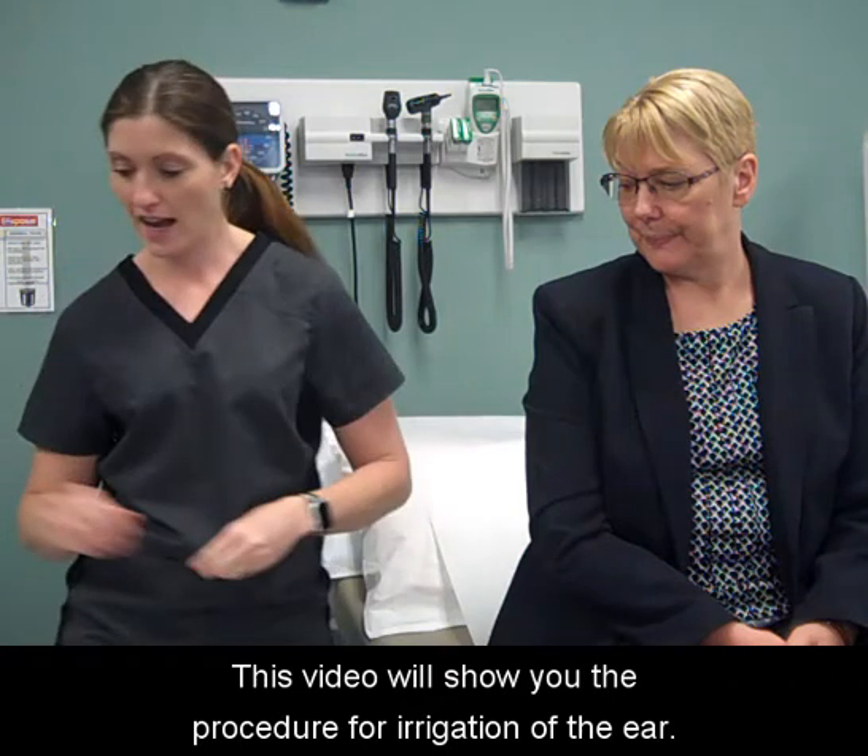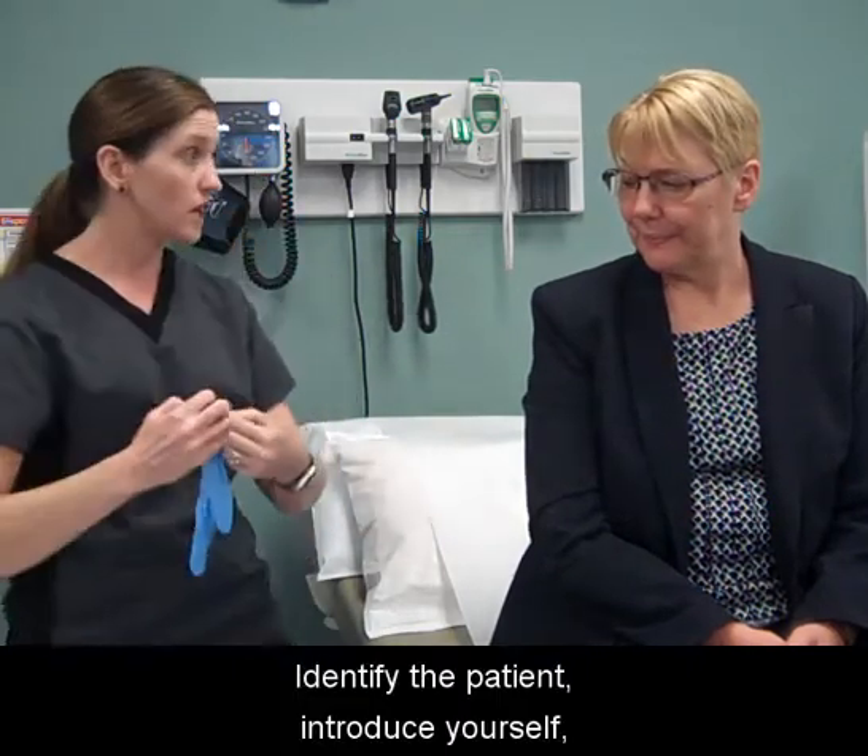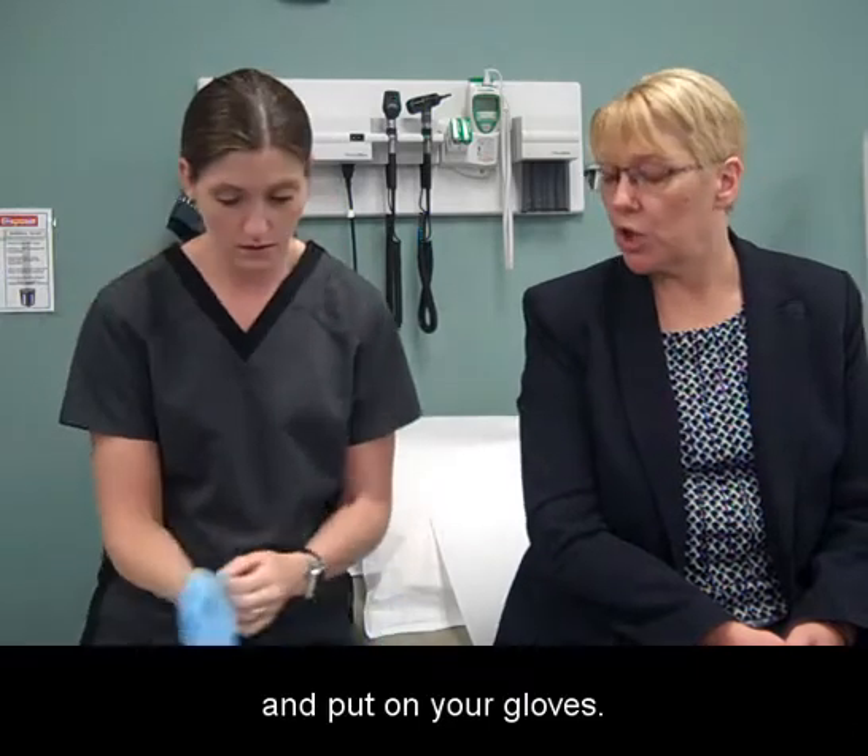This video will show you the procedure for irrigation of the ear. Wash your hands. Identify the patient, introduce yourself, and put on your gloves.